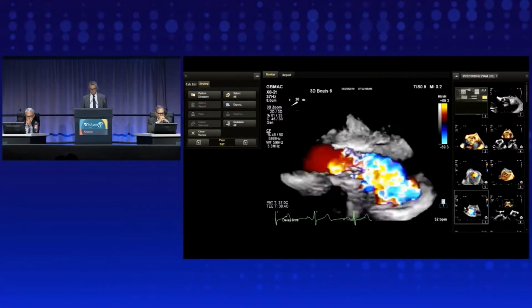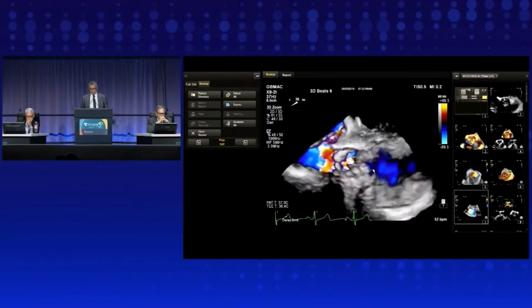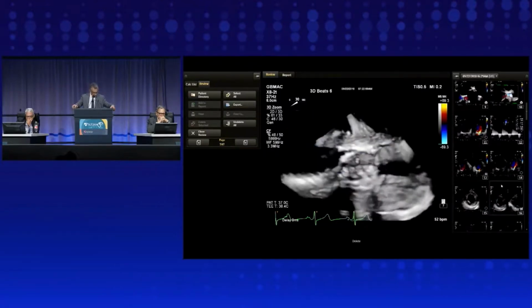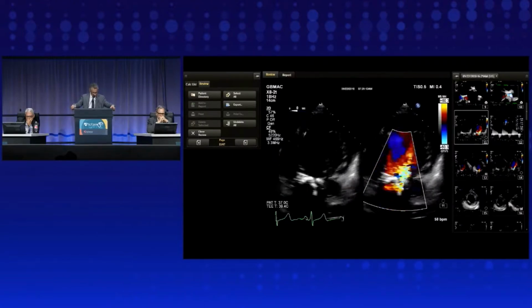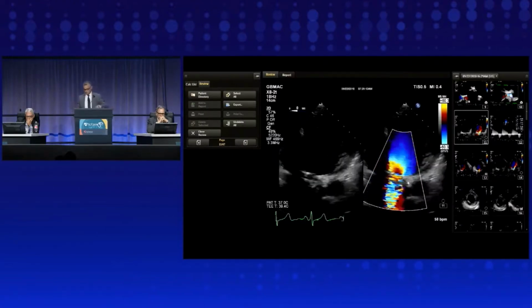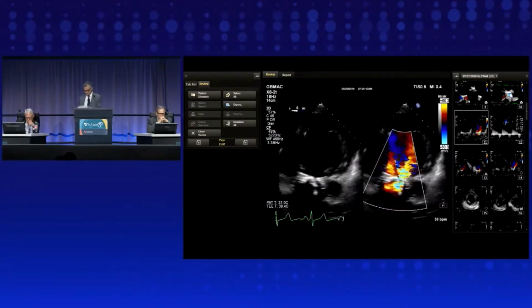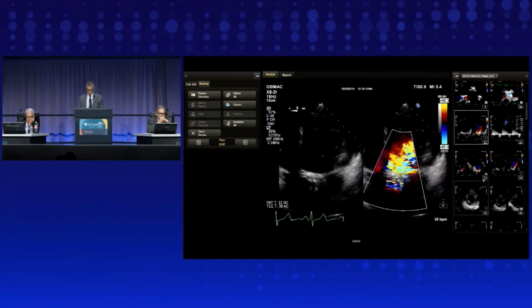Here's the significance of the aortic regurgitation. The LVOT in this particular image is on the right-hand side, and the aortic side is here. So you see tremendous backflow into the left ventricle. Again, we'll see it from a different point of view, which was an opportunity to go deep transgastric. And you have a color compare image in 2D with significant AI and the forward flow PISA, and on the left-hand side, the thickened leaflets again.